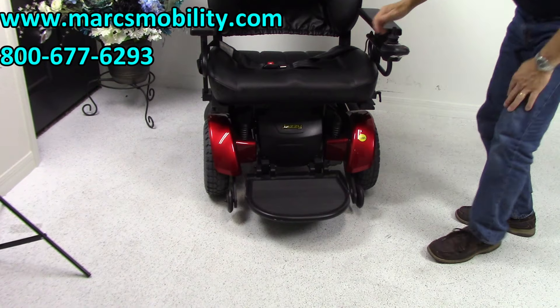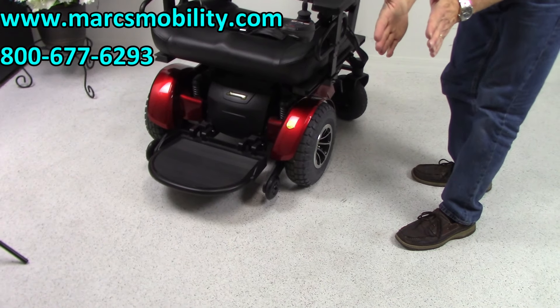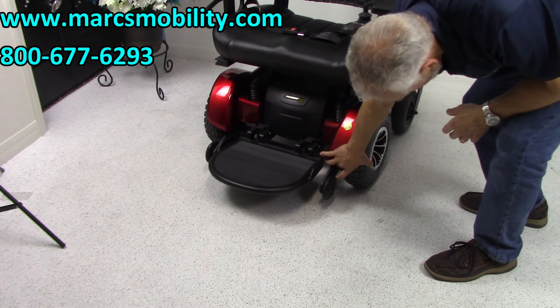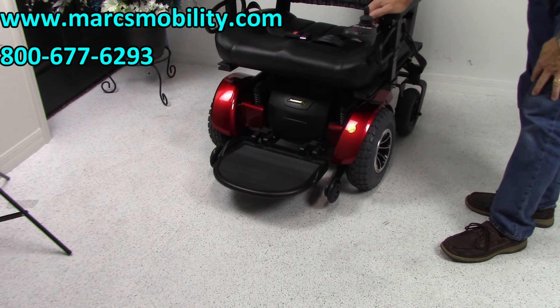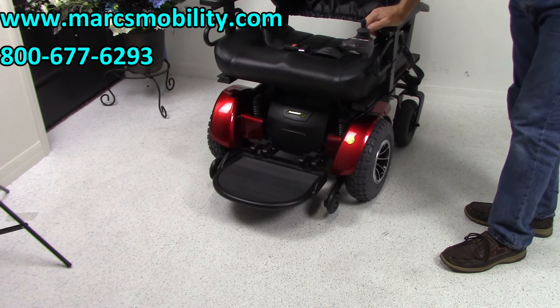You can see the size of the tires — these are 14-inch by 4 to 5 inches wide. They're really wide. So if you're going to be outside, this is the type of tire you need because this chair has heavy-duty motors.